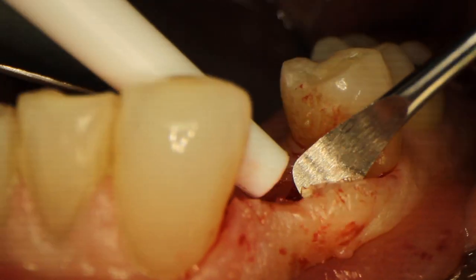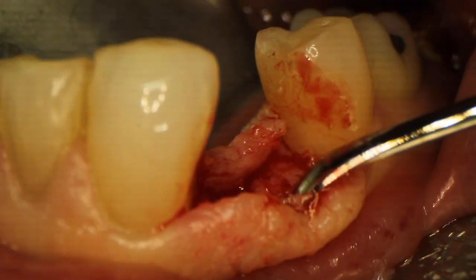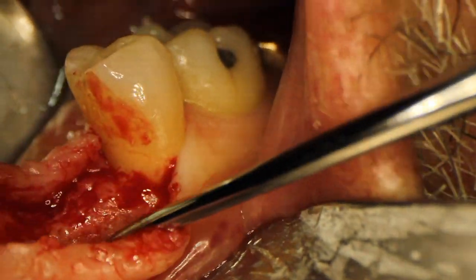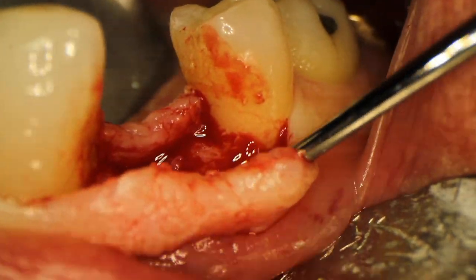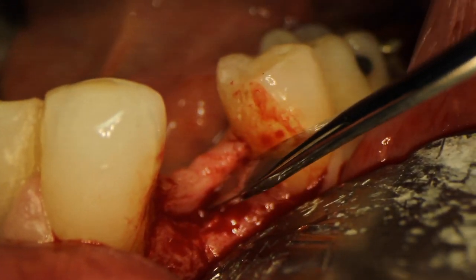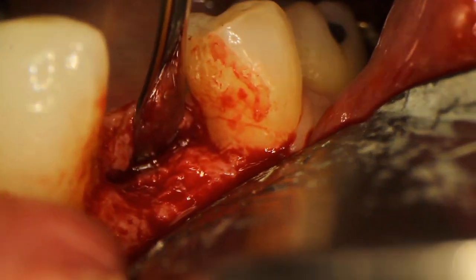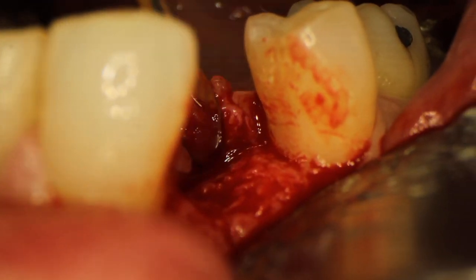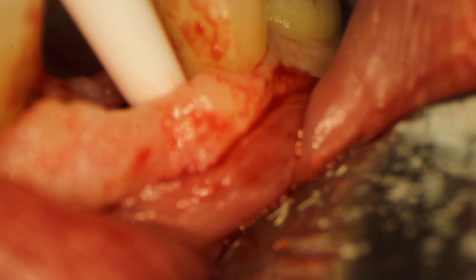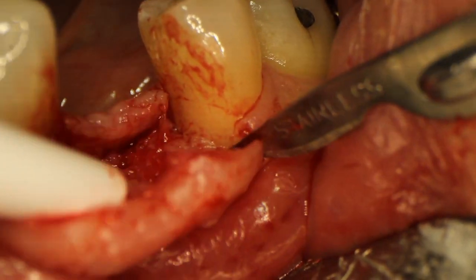Now I'm taking my Woodson periosteal elevator to reflect my flap downwards, peeling the tissue off of the bone on the buccal and then on the lingual. I take my time making sure I get all that fibrous tissue off of there, because especially after a socket graft there's sometimes a little bit of fibrous tissue hanging around the extraction site. I've cleared off the buccal tissue and I'm lifting the lingual tissue off as well. You want to be really careful your instrument doesn't slip, but make sure you can visualize that whole lingual border so you know the midpoint of the bone. I'm going to do a small releasing incision at the distal and a small one at the mesial so we can see everything a lot more clearly.